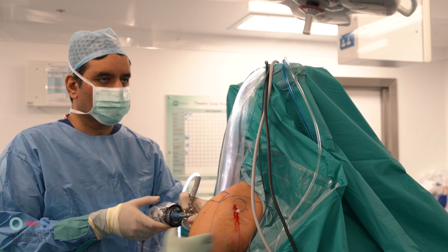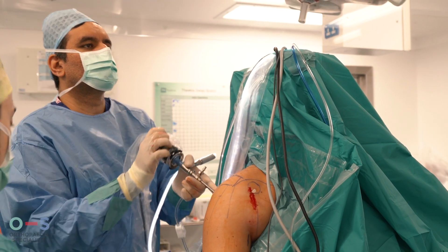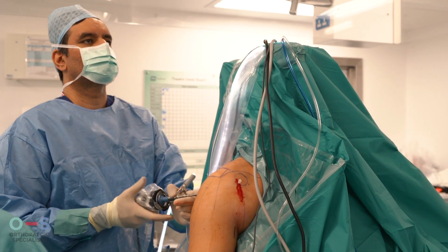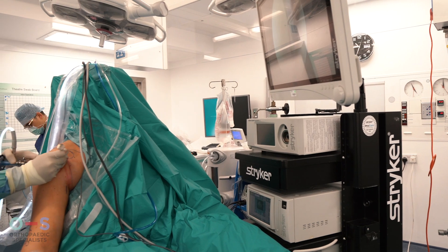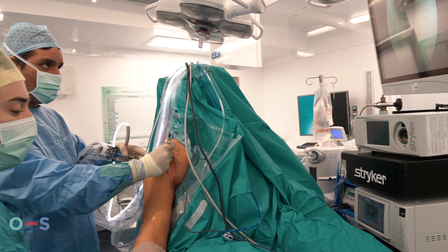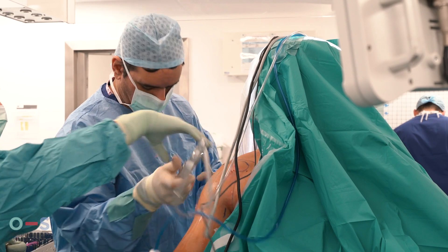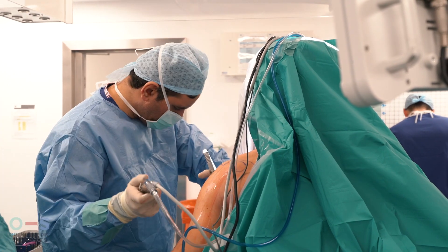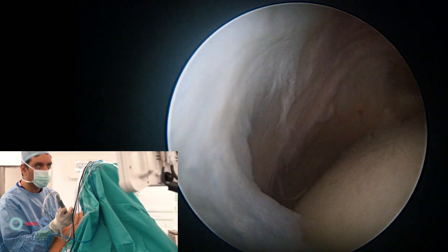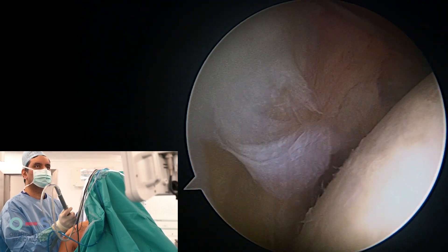The first part of the arthroscopy is to confirm all the damage that we have suspected from our clinical examination as well as the MRI scan. Then we use several instruments including a shaver to prepare the damaged areas for repair.